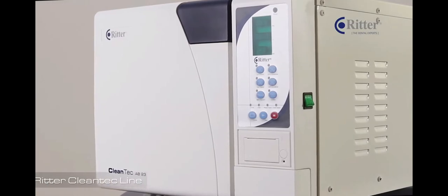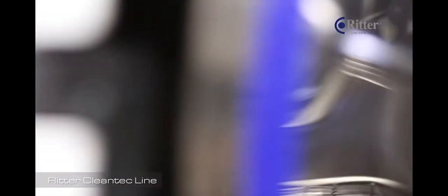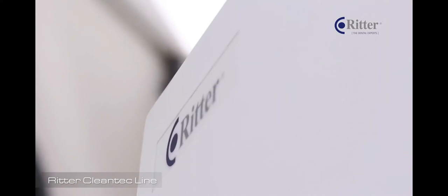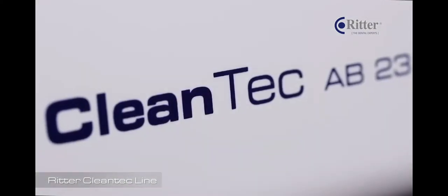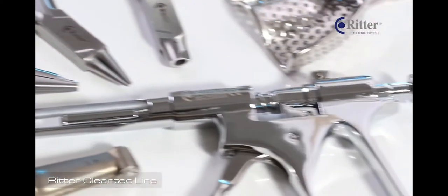Powerful, reliable and most effective. The first class of sterilization. The autoclaves of the Ritter Cleantech line are class B all-in-one sterilization systems.